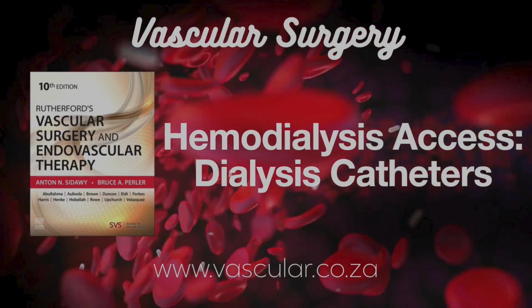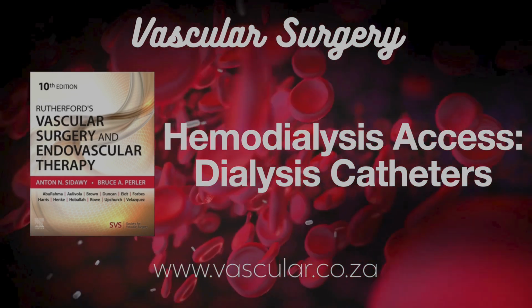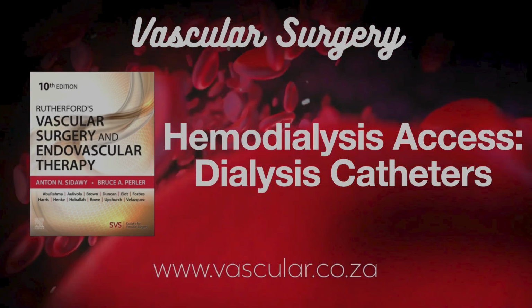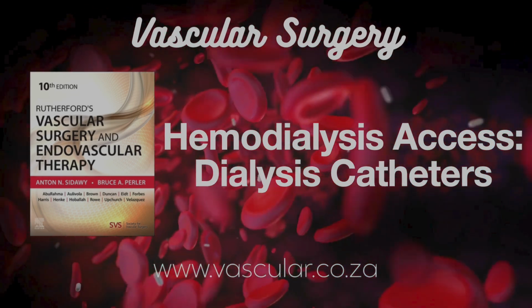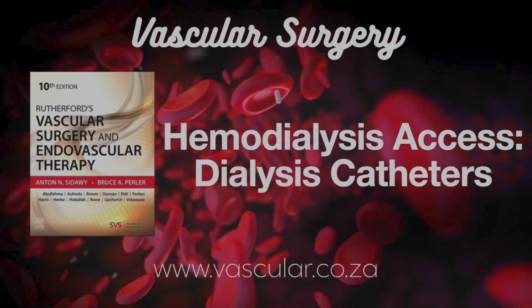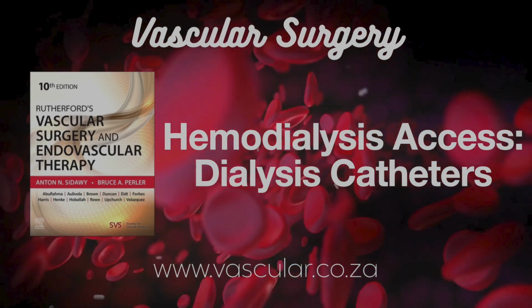Okay, evaluation complete. We know the patient's anatomy. Time for insertion. Where's the preferred spot to put these TDCs? Generally, the right internal jugular vein, the right IJ, is the go-to site. Why the right side specifically? It offers a shorter, straighter path down to the right atrium of the heart. Less kinking, potentially better flow, and studies show these catheters tend to last longer compared to left IJ placements.